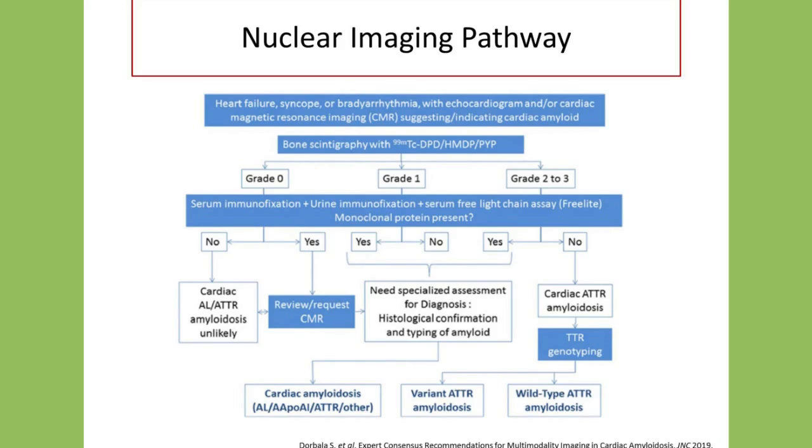So having your physicians follow this algorithm along with interpretation can become very helpful to the referring physician in understanding where the patient's disease progression and type falls.